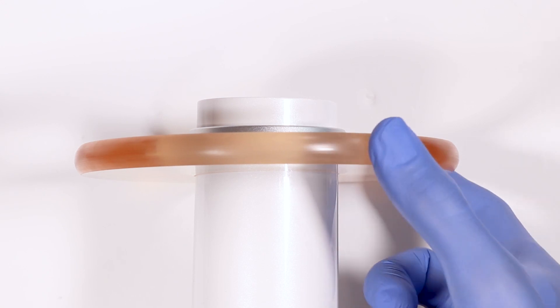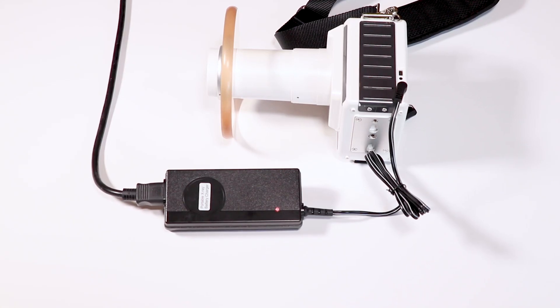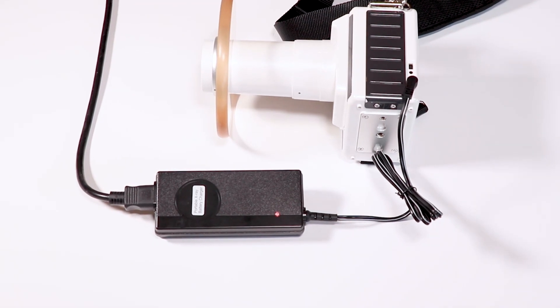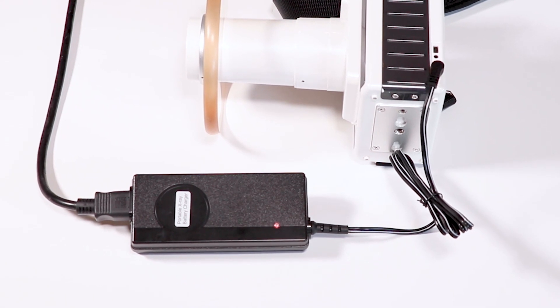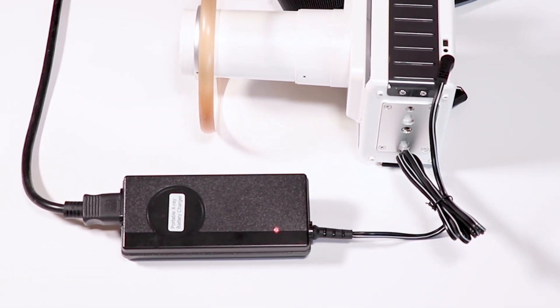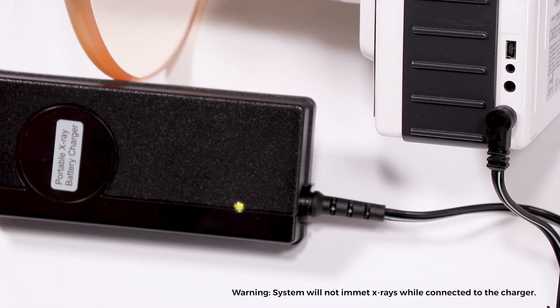The bottom of the x-ray is a connection plate for arm mounting. Note that the backscatter shield on XTG is fixed. When charging the unit, a fully depleted battery takes approximately three hours to charge. The red light on the charger will illuminate, then change to green when fully charged. This system will not emit x-rays while connected to a charger.